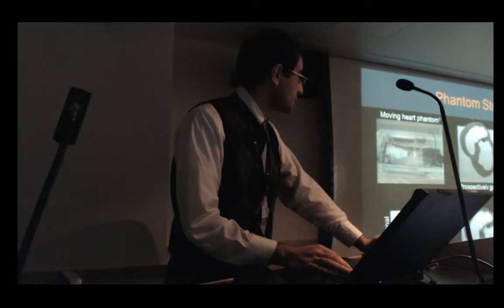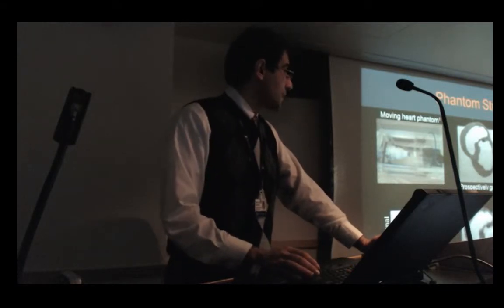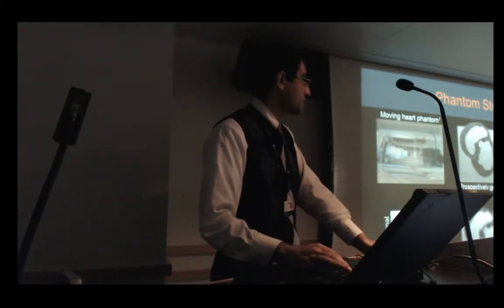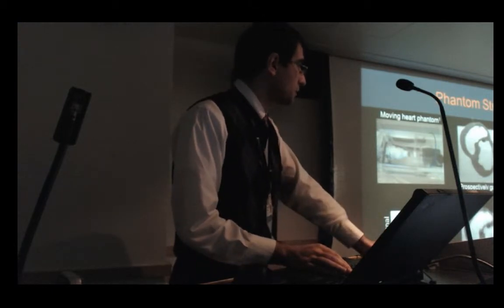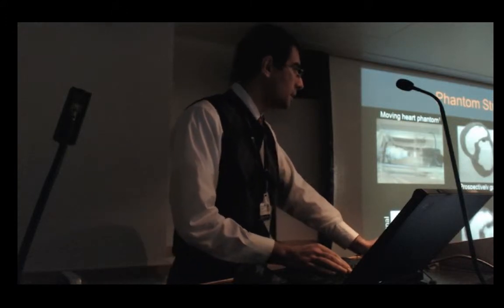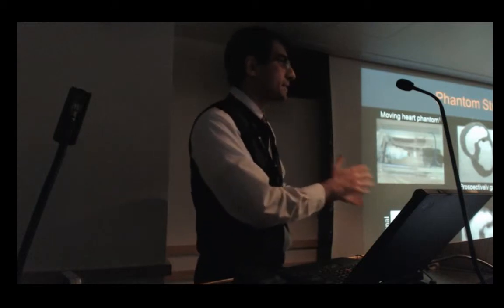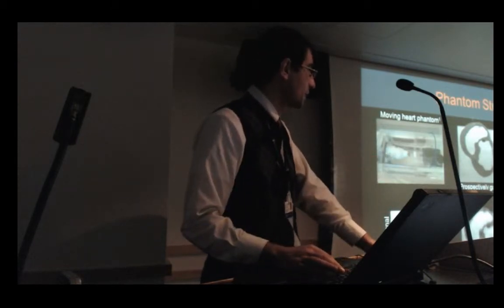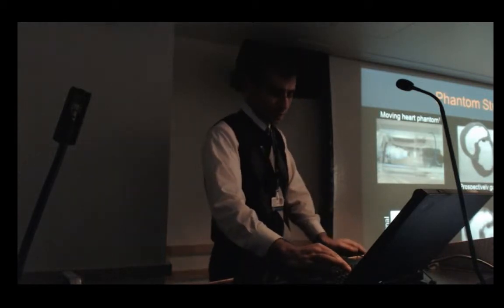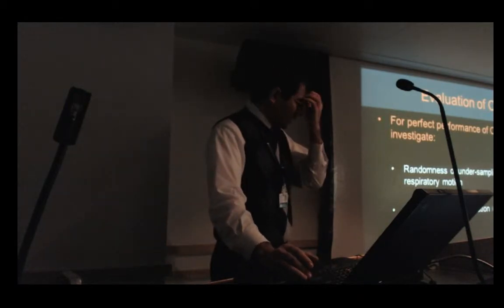In Cosmo, we only acquired the 10 to 20 heartbeats gated, and then we open up the gating window to accept the rest of the k-space lines. You can appreciate we have a semi-corrupted image because the center has been acquired without motion, while the outer k-space has been acquired with motion, so we have some motion artifact. Then we generate the zero-filled image by replacing the motion-corrupted k-space lines with zero. We send the zero-filled image to the CS algorithm to estimate the motion-corrupted k-space lines and improve the image quality.